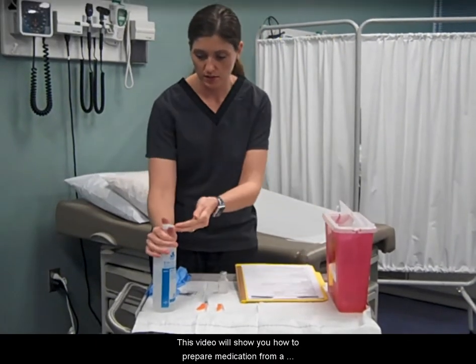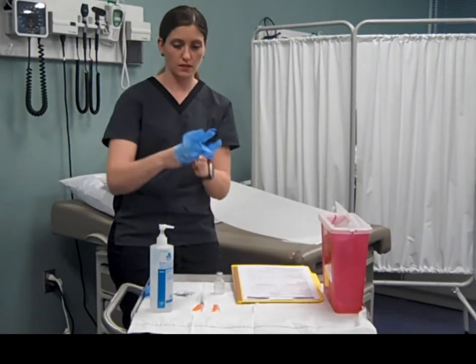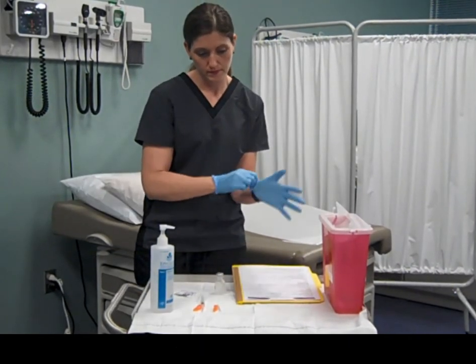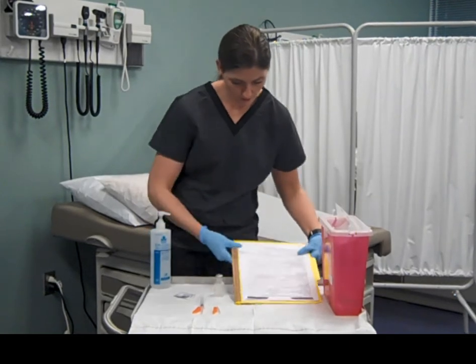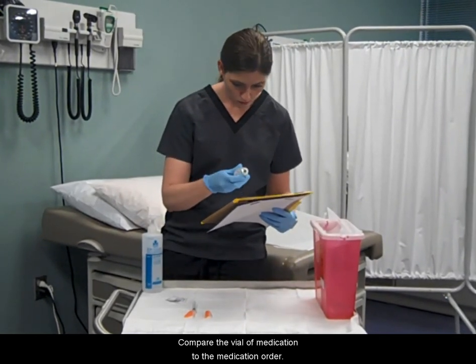This video will show you how to prepare medication from a multi or single dose vial. Wash hands and apply gloves. Compare the vial of medication to the medication order.